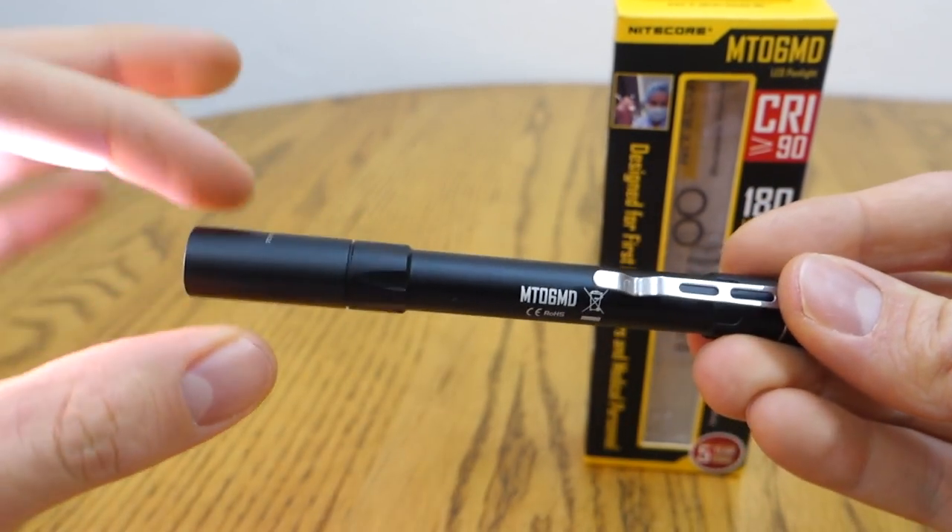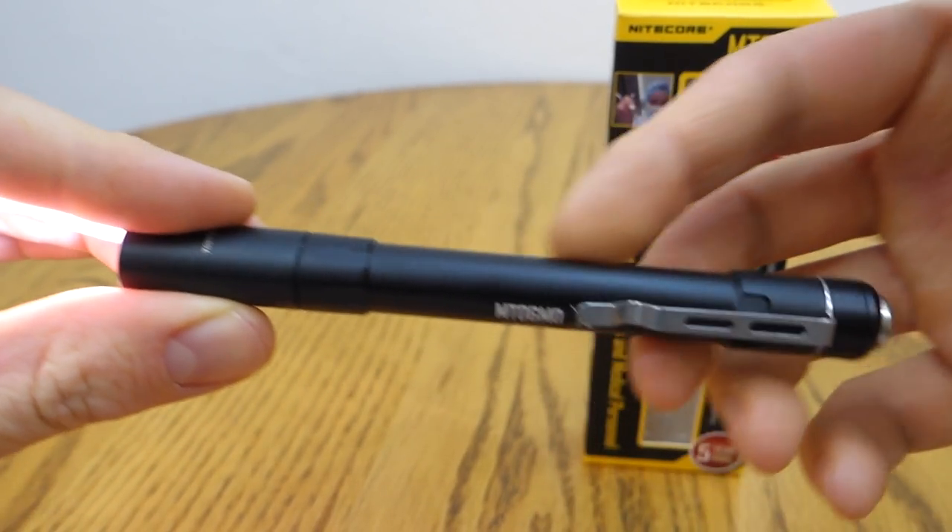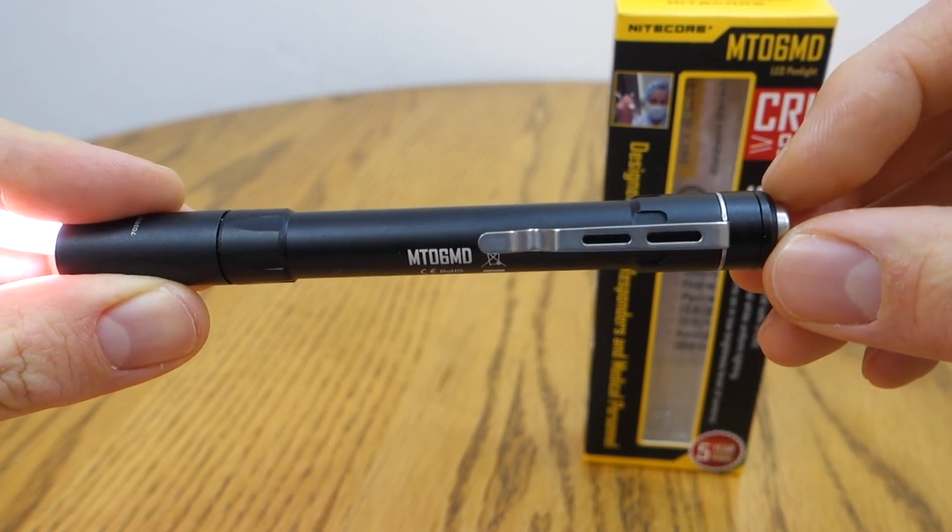Just taking a quick look at the light, we've got a head connection here, and then the body, the battery tube, and then the switch here at the end.